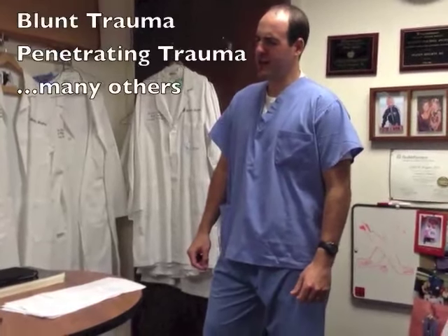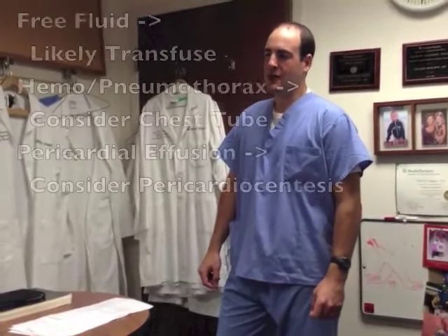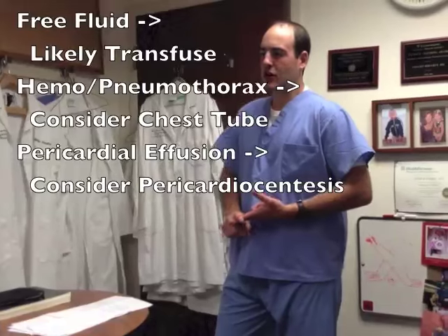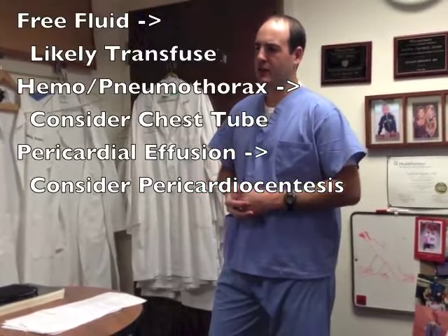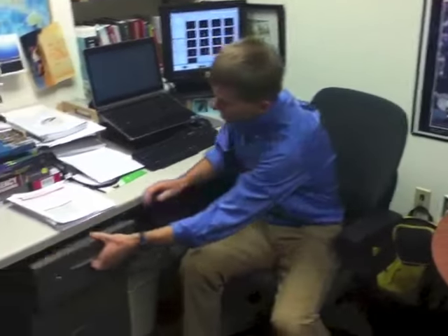What are the indications for it? Any blunt or penetrating trauma. And when is it most useful? It's most useful in hemodynamically unstable patients because it will help guide your treatment — whether you need rapid fluid or blood resuscitation, or possibly a quick intervention like a chest tube or needle thoracostomy, or even a pericardiocentesis. Very good. Your timing couldn't be more perfect. Perfect for what? Come with me.